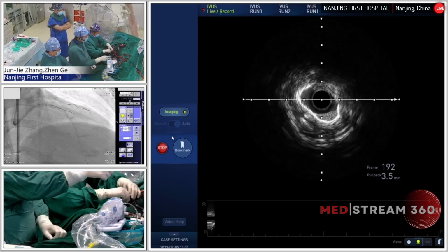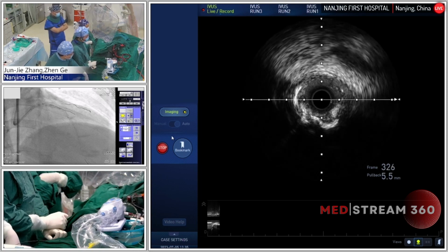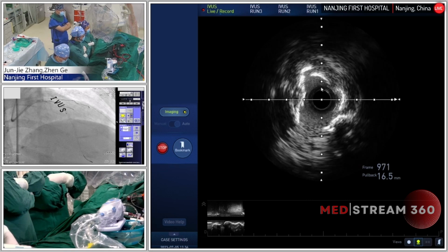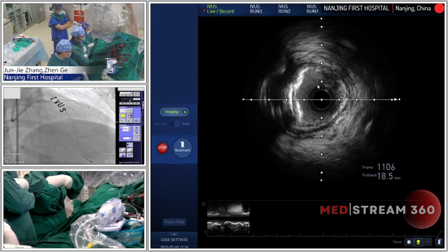Yeah. Dr. Pan, you introduced the IVUS image. Lumen area is very small, and here we cannot clearly see the crack. And here we can see medial dissection. There are at least 2 or 3 cracks. Very effective lithotripsy for this case.